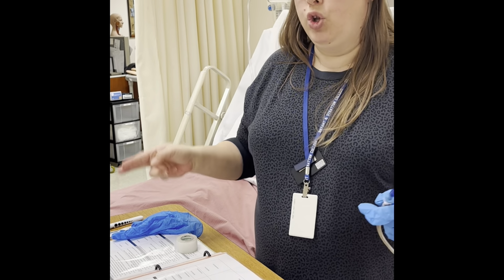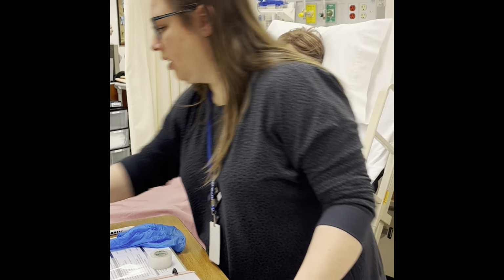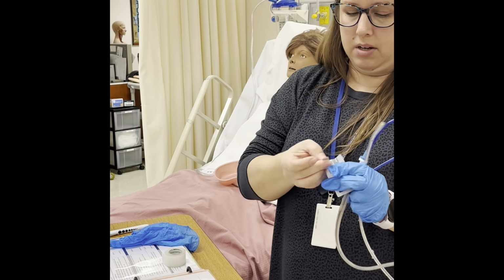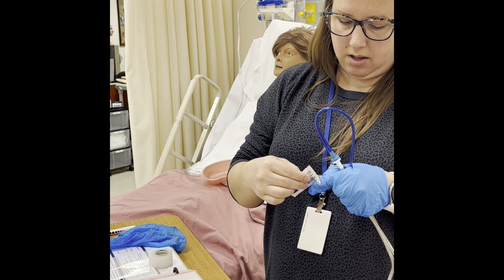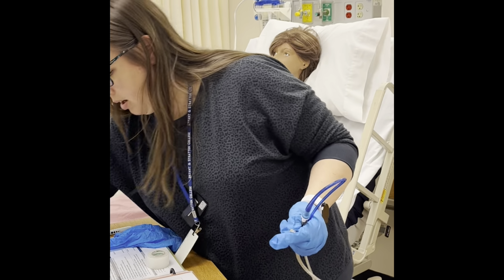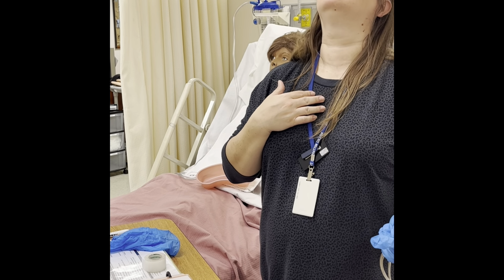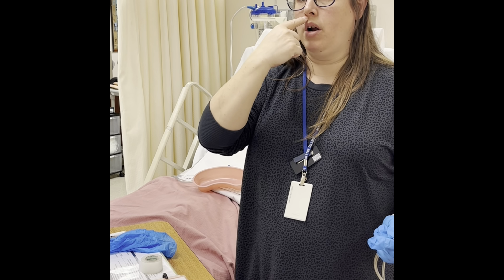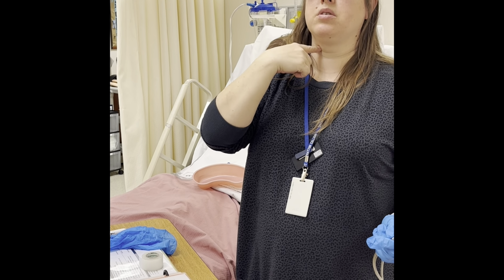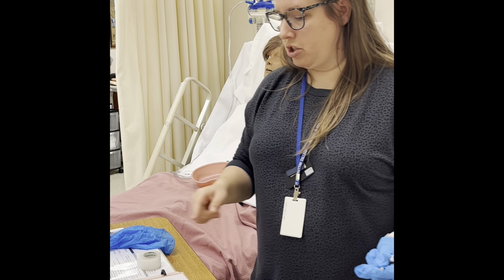So we have that attached to that. And then it says lubricate in quotation marks. We're going to pretend to lubricate because they don't want you guys using a bunch of lubricant on the mannequins. I'm just gonna use a tiny bit because it's probably dry from yesterday. Just an itty bitty. There, just a tiny. Tell your client to put their head back so we're getting more of a direct shot. What we're doing is we're trying to go from the nose to the back of the throat. So by having them tip their head up, we're getting a more direct shot.